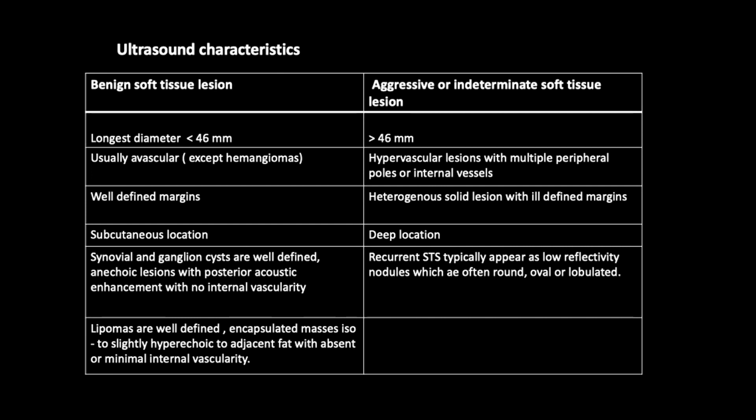So in this case, the patient was saved on ultrasound. I raised a suspicion. Then a further modality was done and the patient was surgically treated. So thank you. These are the cases for the day.